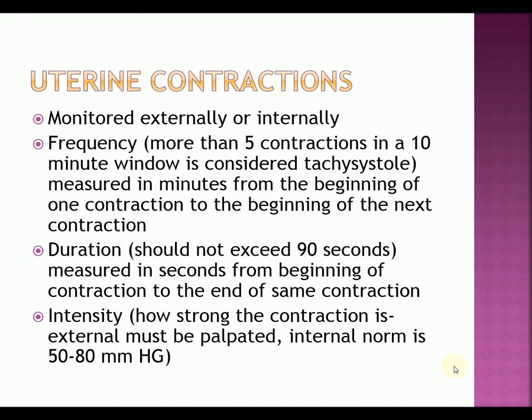Without this relaxation, the baby's not getting any oxygen. And this is very important, that we have resting tone and that we always document resting tone, especially when we are doing Pitocin, oxytocin induction, or any type of induction. So with the external monitor, when we're laying our hands on it, we should be able to palpate soft. That's the language we're supposed to use.